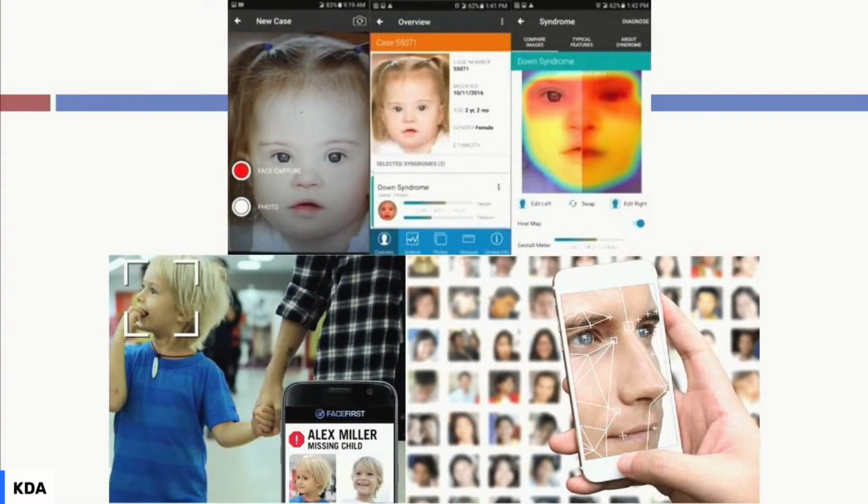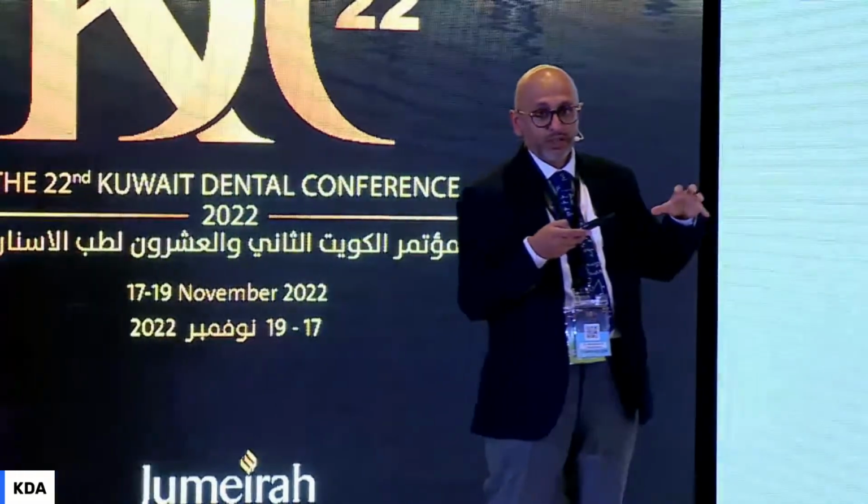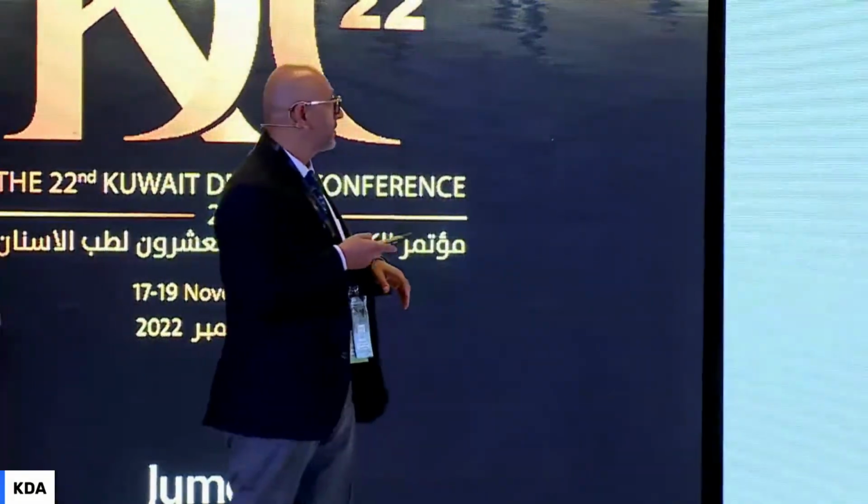We can use soft tissue facial scanning of a similar soft tissue envelope and try to superimpose the coloring on top of that. Now, in terms of face recognition and in the forensics field, this is being used heavily, and we're using some features now in the medical application, the same features that are being used in the area of forensics. We are applying that for artificial intelligence in the field of maxillofacial surgery.